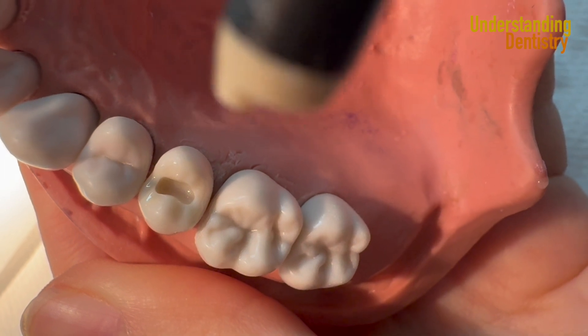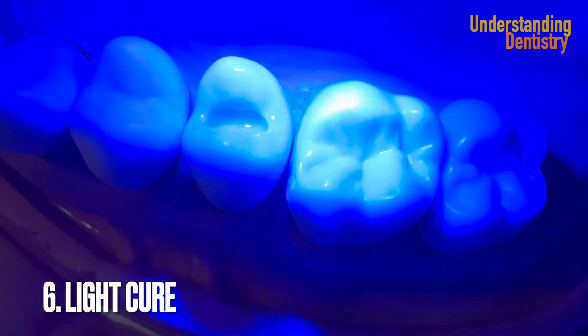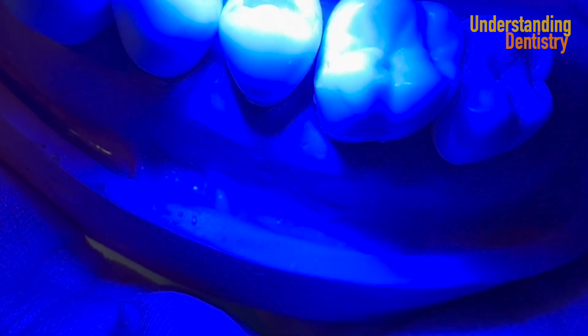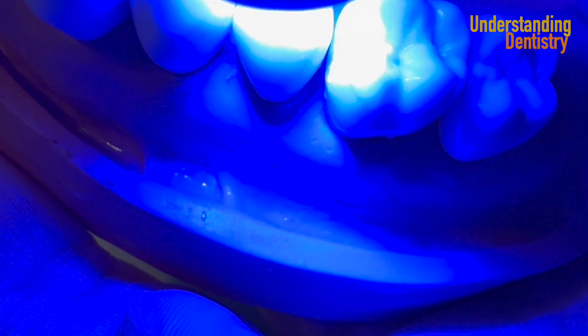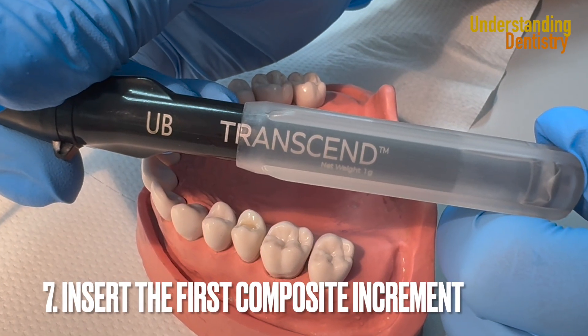Air dry now — take a look at this. You get this shining appearance, and that's correct. Then you light cure. If you light cure closer to the preparation it's even better; it makes a difference and it's already proven by the literature.